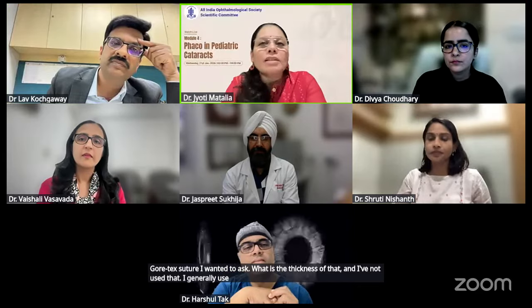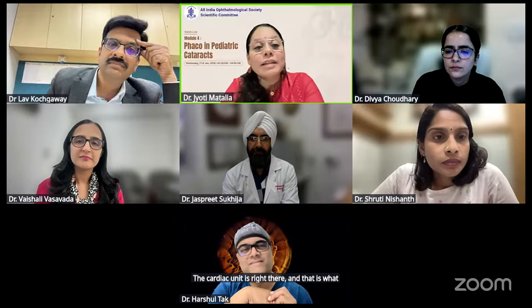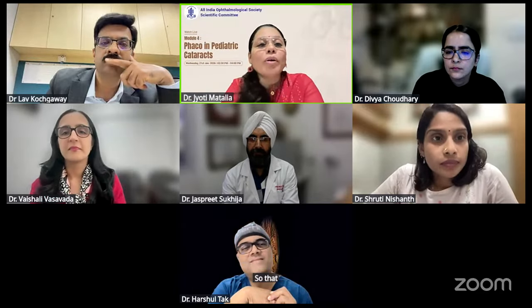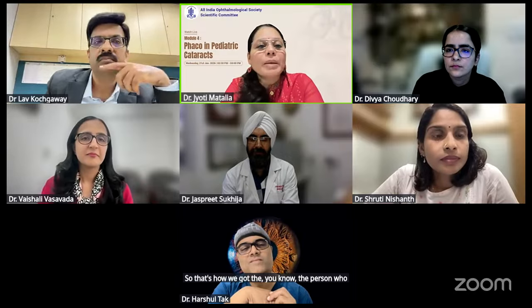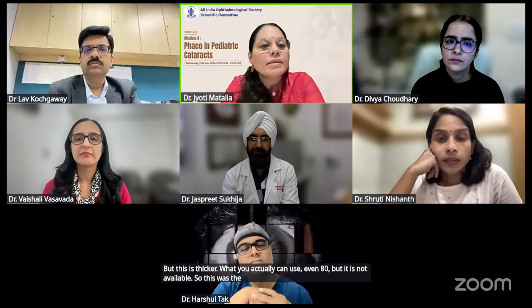I've not used that. I generally use 9-0 Prolene. So this is around 7-0 Gore-Tex. The advantage I had is because I was in Narayana Nethralaya Health City. The cardiothoracic unit is right there, and that is what the cardiothoracic surgeons tend to use. So that's how we got the person who gives it. But this is thicker. What you actually can use is even 8-0, but it is not available. So this was the highest we could get in Bangalore.